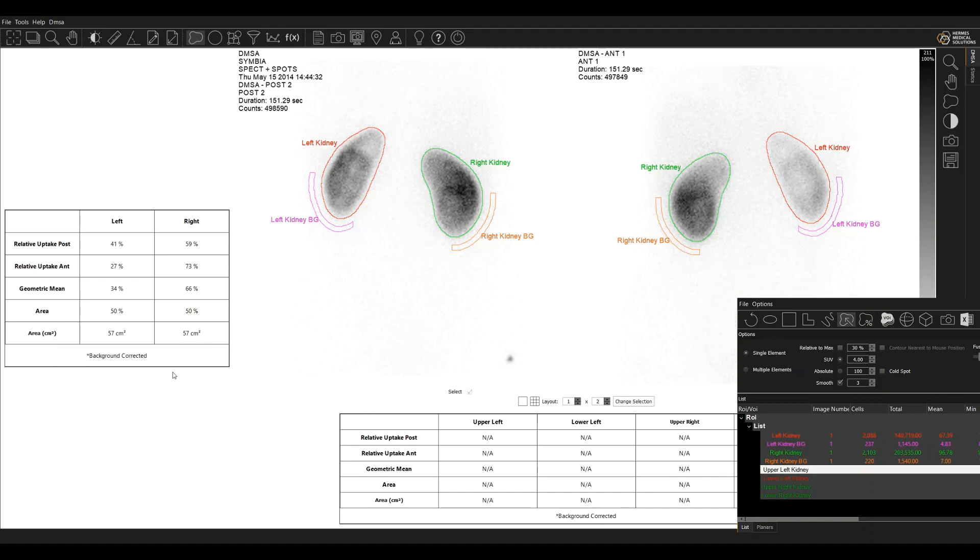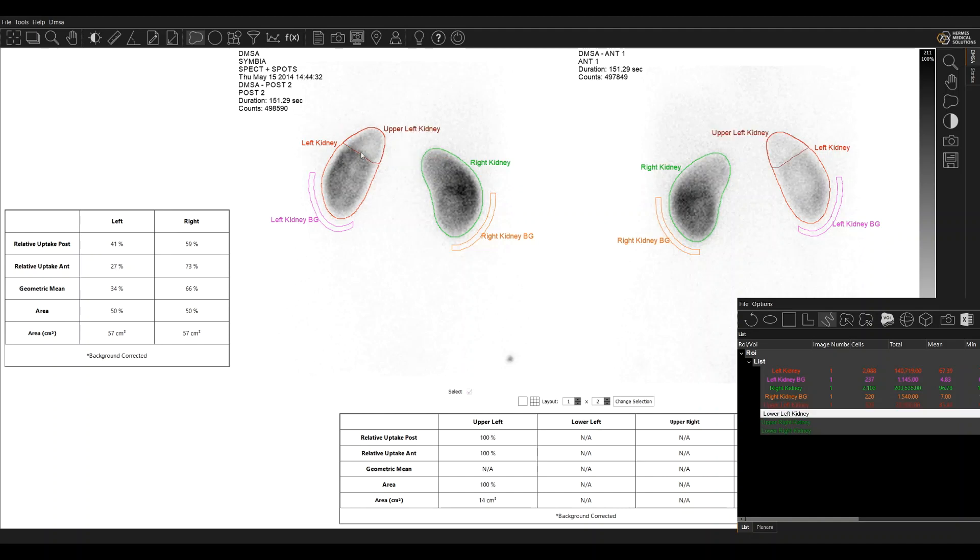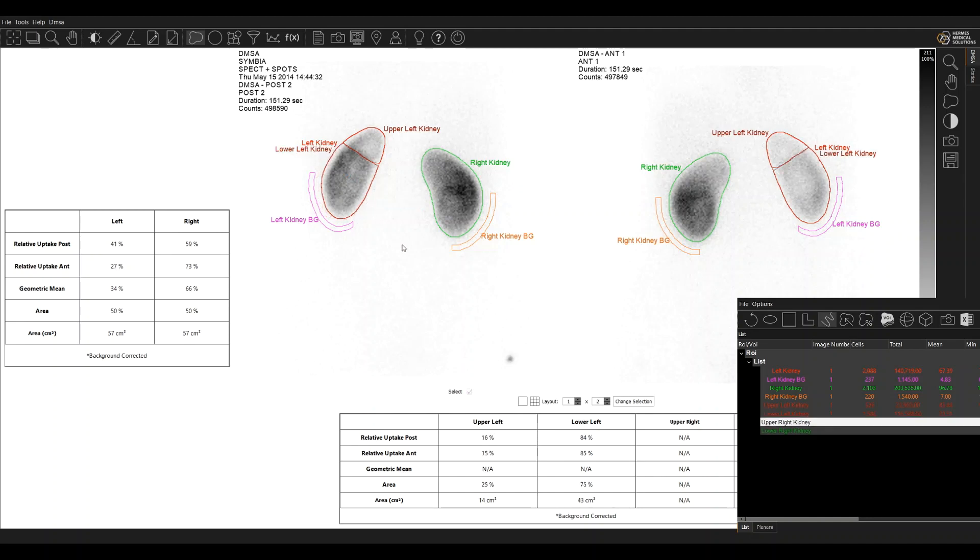But for this case, we have a duplex kidney on the left hand side. So I'm going to do some further processing to find the contribution of each of the duplex portions of this kidney. So the upper left kidney, I will use the freehand tool just to draw that portion. So we draw the split through and then just carry on around the outside. It will be constrained to be inside the kidney region. So you don't have to be too accurate when going around the outside of this. And there we go. We have the results now for each portion of that duplex left kidney.